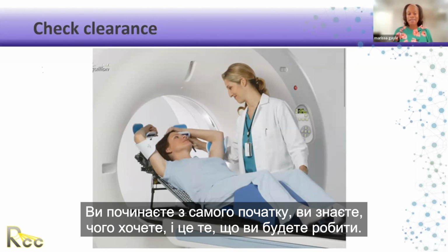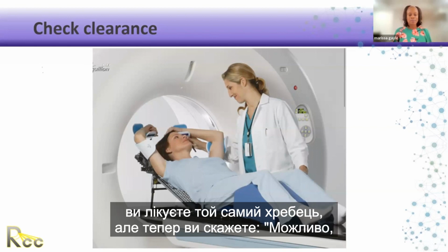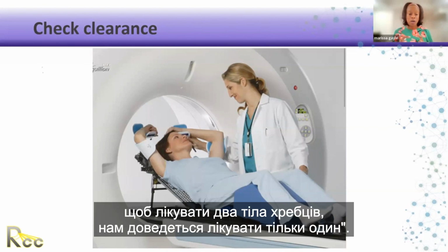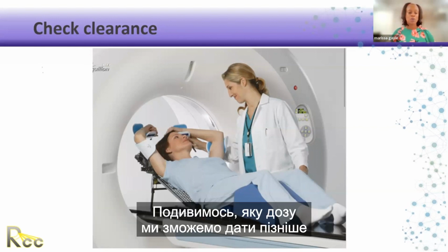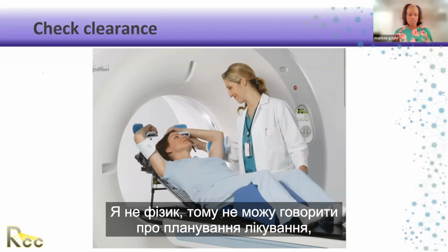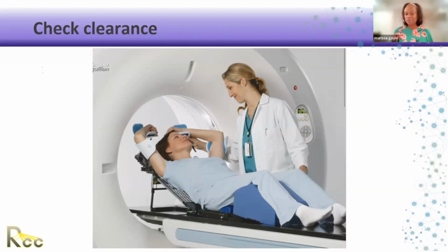Whereas with inverse planning, let's say you're treating the same spine, but now maybe we could do an SBRT plan, and instead of having to do the 2 vertebral bodies, we'll just do this one. We're going to create some fancy field arrangements. We're going to see how much dose, maybe we could give more dose posteriorly at different angles. Maybe we'll do an arc. The options are numerous. I'm not a physicist, so I can't talk about treatment planning, but I can tell you that will be the difference. Does that answer it a little bit better?